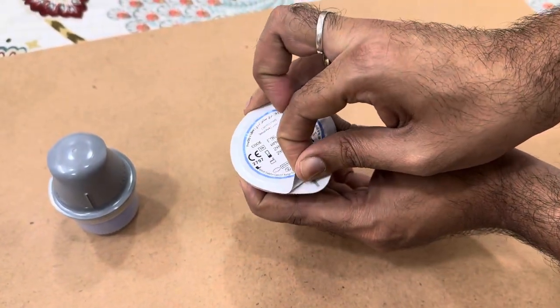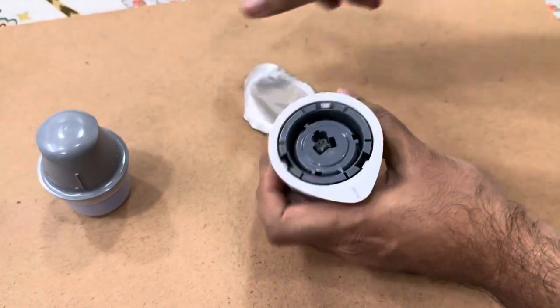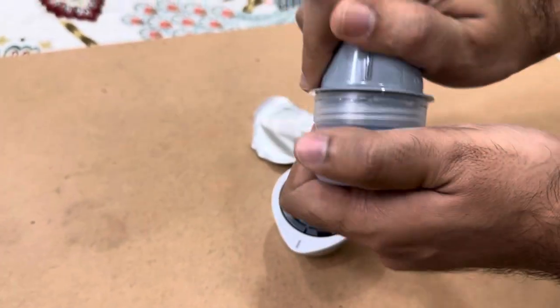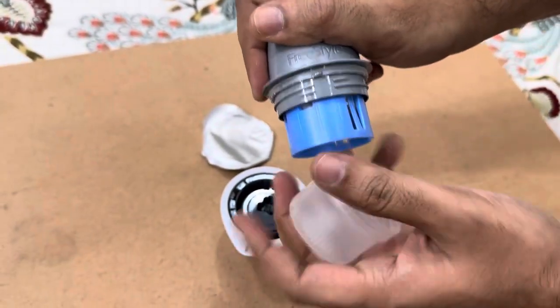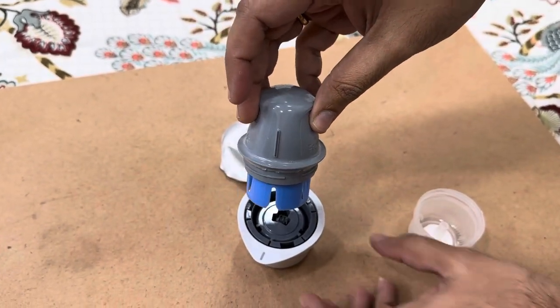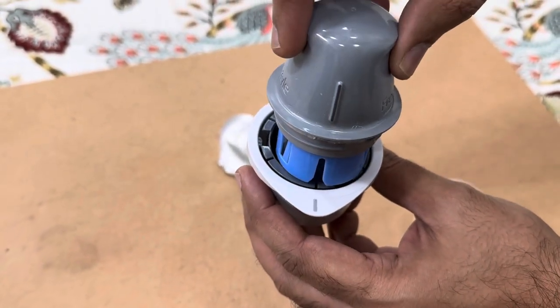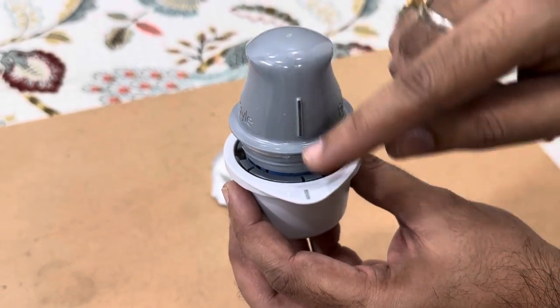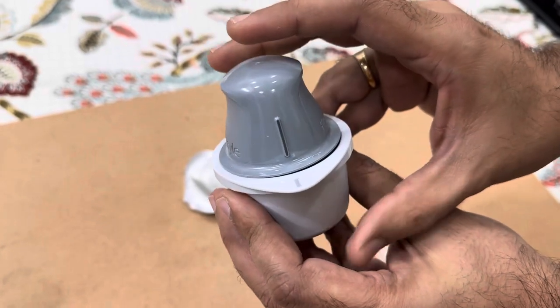Let's open the sensor pack — peel it off from here. This is how the sensor looks once peeled. Now open the applicator — there's a click sound when it opens. You need to align the dark line on the sensor with the line on the applicator. Make sure both lines are aligned, then you should hear a click sound.